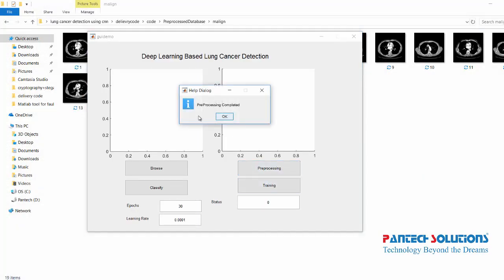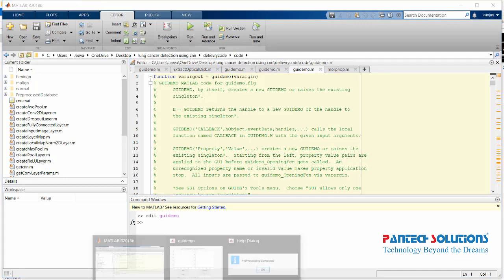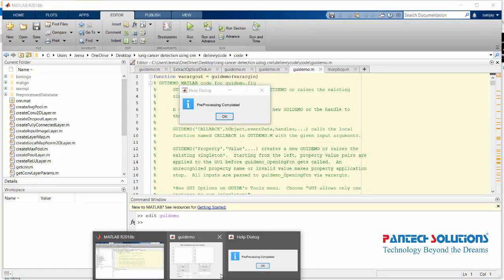Once the process is done, you will get a dialog box saying pre-processing complete.